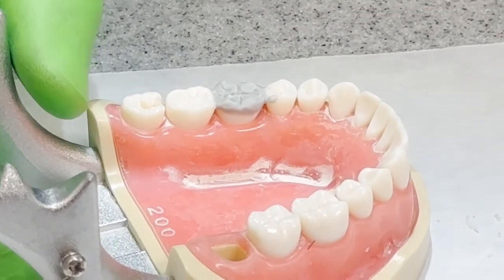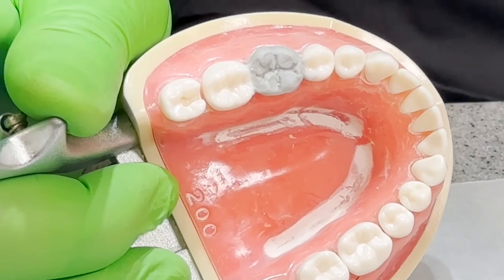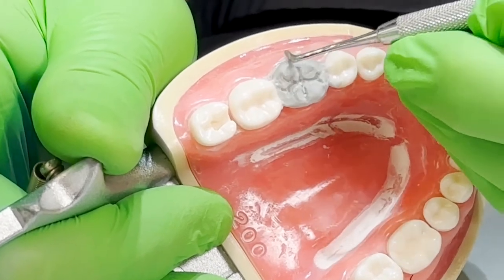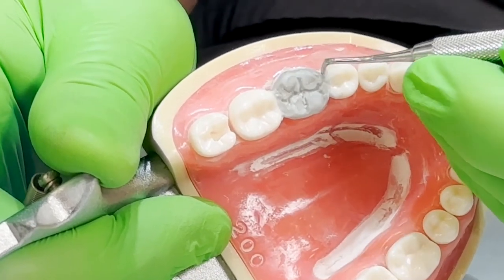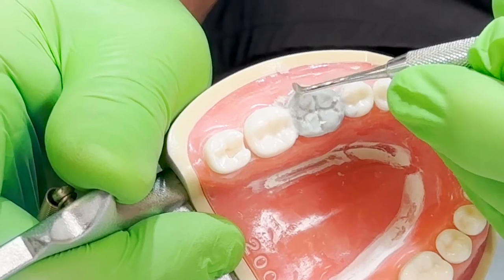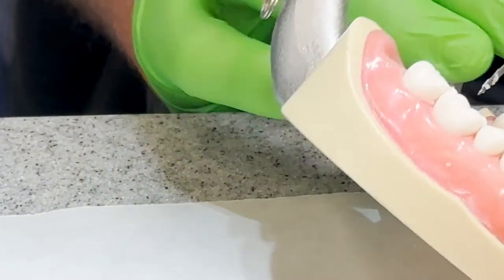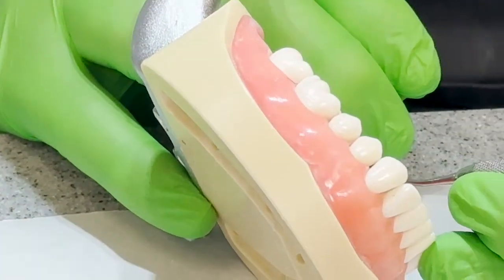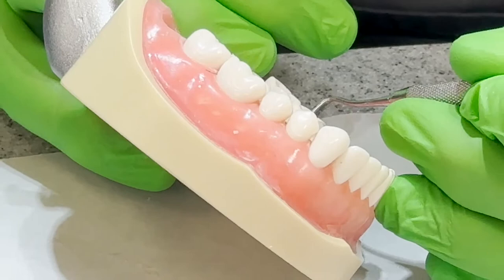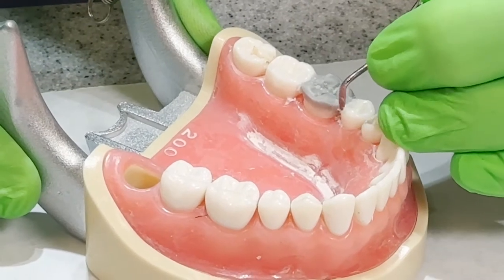I use the discoid-cleoid on the outside surfaces. I'm going to go ahead with either my half Hollenback or my full Hollenback. I want to get that margin right back to the typodont tooth, okay? See how that works? I'm going to use the tooth portion to show me where I need to go with that. And the same on the lingual here. And even interproximal, I'll clean this up a little bit.